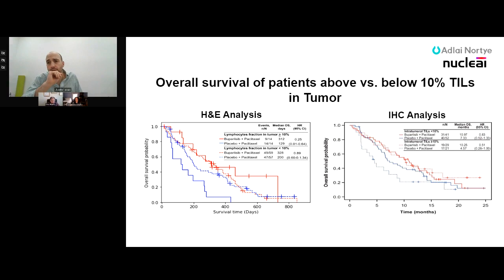The first thing we wanted to do before we looked at anything novel was determine, could the H&E slide that we had and the model that we built with Nucleai reproducibly and accurately compete with the traditional biomarkers, or what we'll call the standard biomarkers, right? So what we first looked at is the tumor infiltrating lymphocytes.